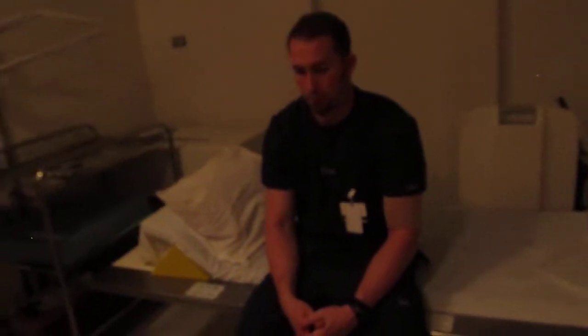RJ? What's up? So here's my patient, and what's your date of birth? 10/6/85. Okay, so I've double ID'd my patient, and he's in the x-ray room, so I'm going to ask you to lay down, sir.